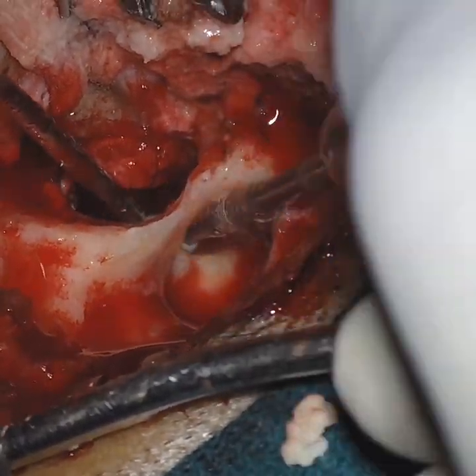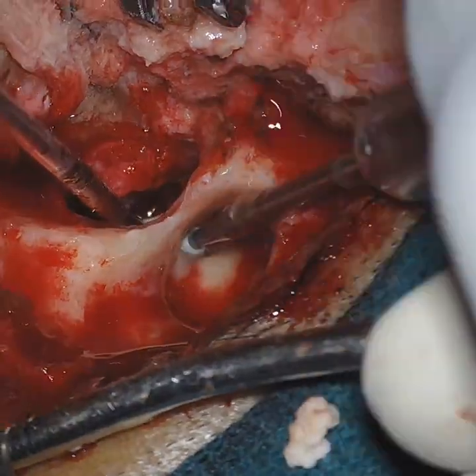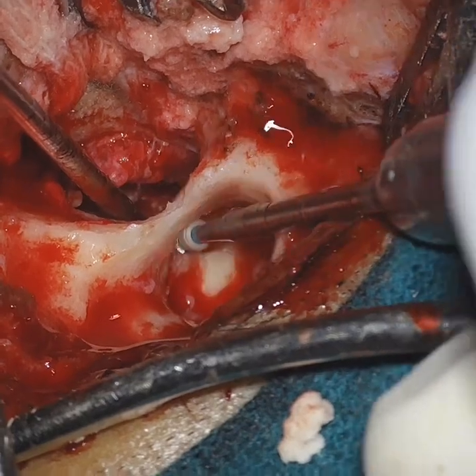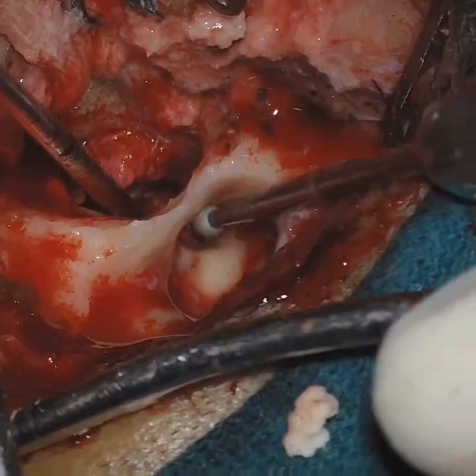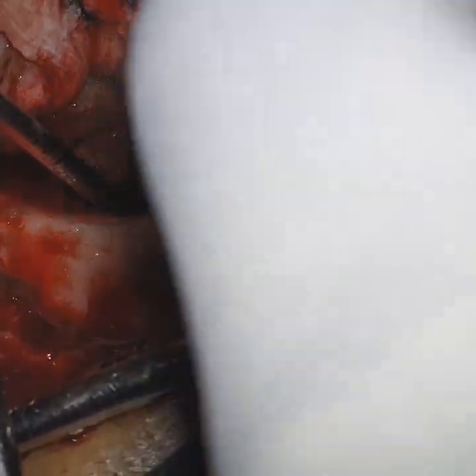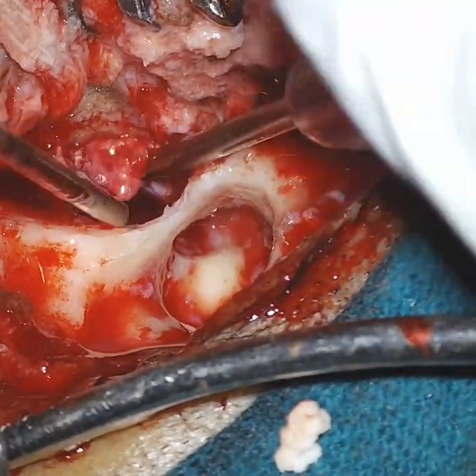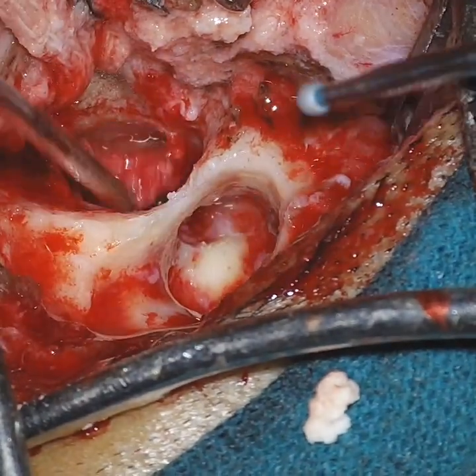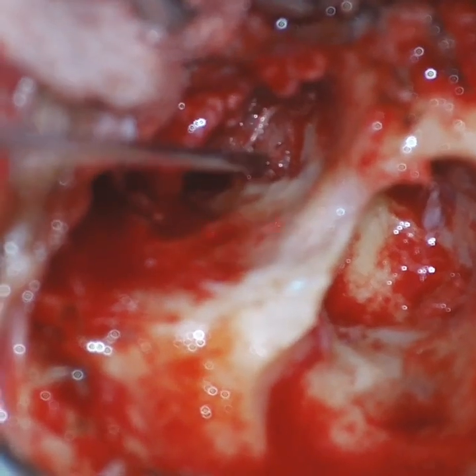So now since the stapes is also eroded, we are exposing the facial nerve. Now you see we are exposing the facial nerve through this route. So finally we are exposing the mastoid and tympanic segment of the facial nerve. And once we expose the facial nerve, we take all the diseased mucosa of the facial recess.